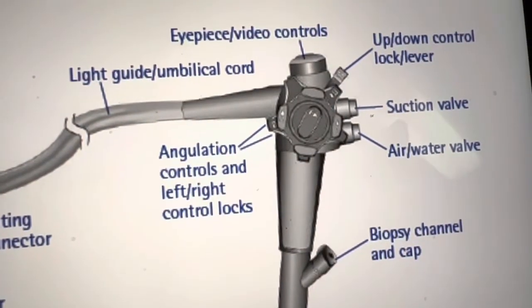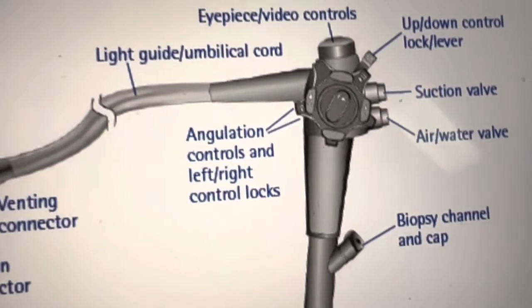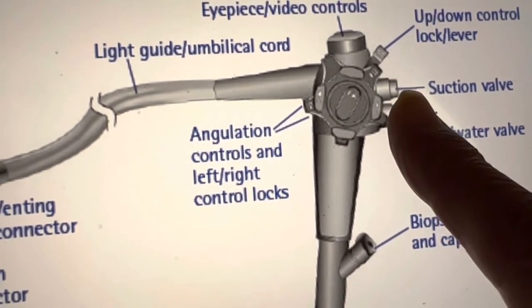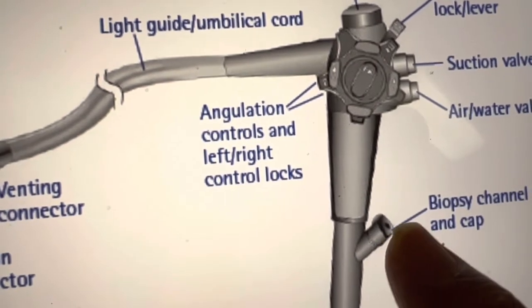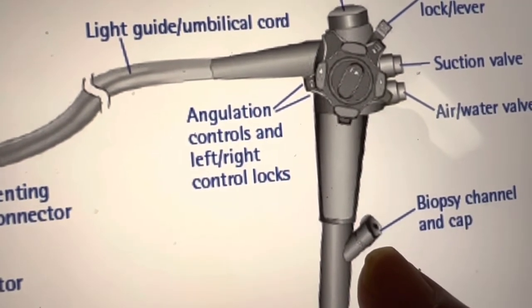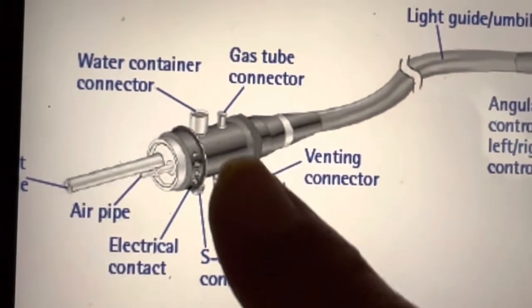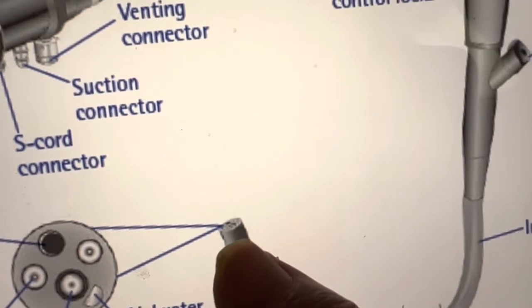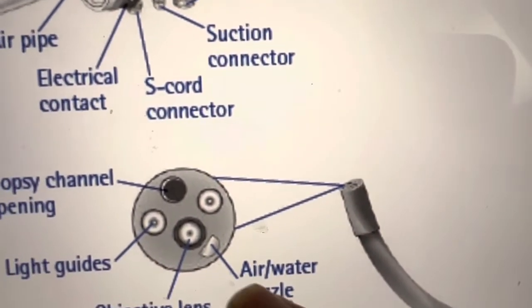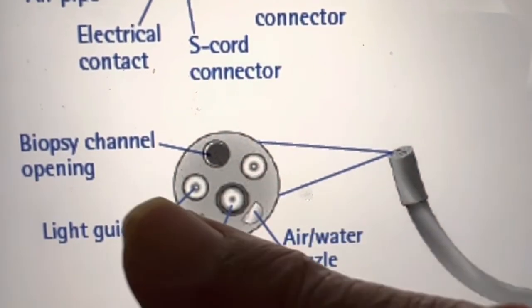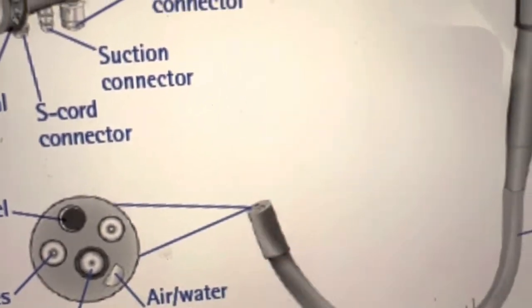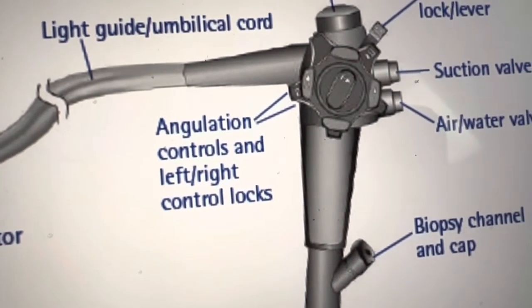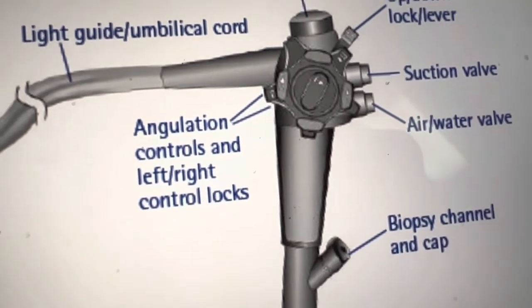This is the colonoscope and I want to show you the various controls. Up here is the air-water button, then this is the suction, and this is the area where we put the biopsy forceps or snare through to take a biopsy of a tumor or for removal of a polyp. This is the light source where you attach to the light source and the light goes to the lower part of the colonoscope. At the tip you see the air-water nozzle, objective lens, light guides, and the biopsy channel. The image is taken through the colonoscope and shown on the screen, from where we look at the colon and manipulate the colonoscope.